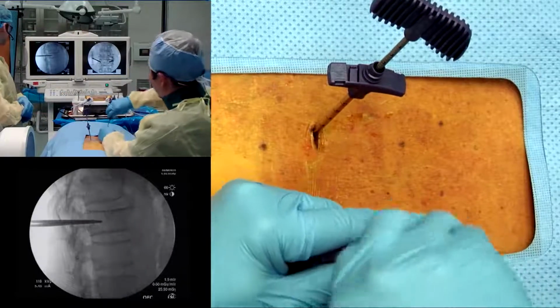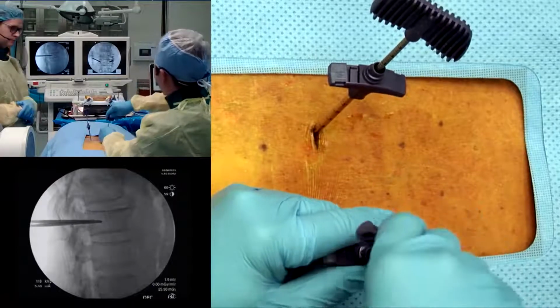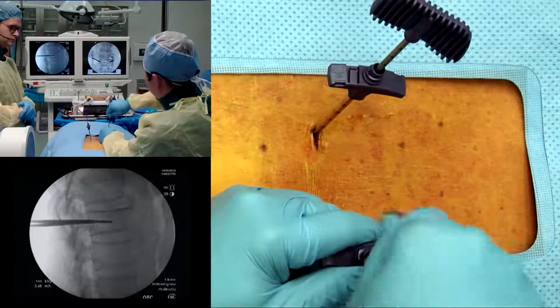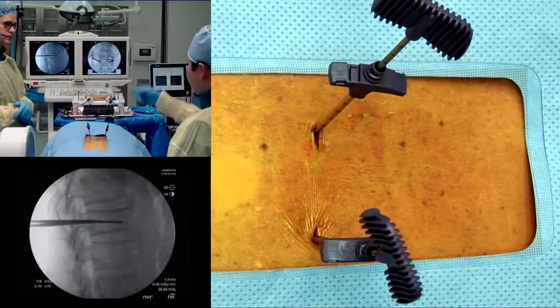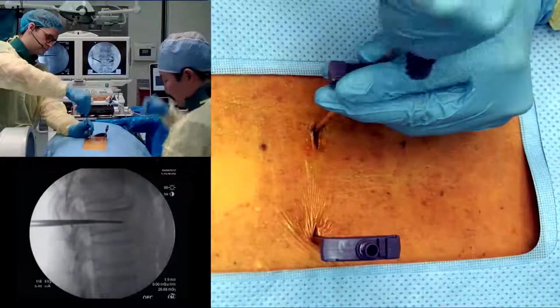And I'm going to try to go maybe like 2 centimeters. Create a little pathway. Picture. Maybe even just a little bit deeper. Picture. And that's about where I want to be. You know, so we're in the anterior zones. So I want you to go the same amount. And I can take mine out so you can take a look at your drill.